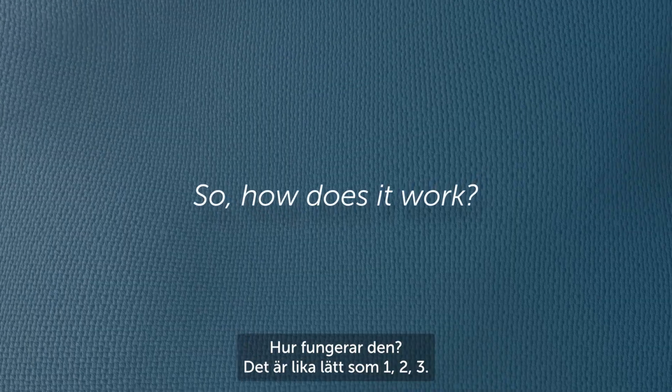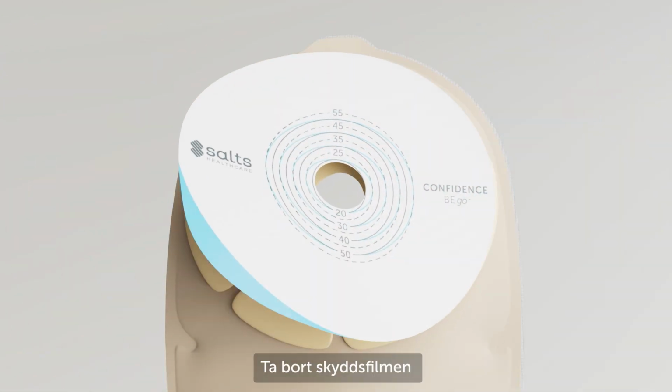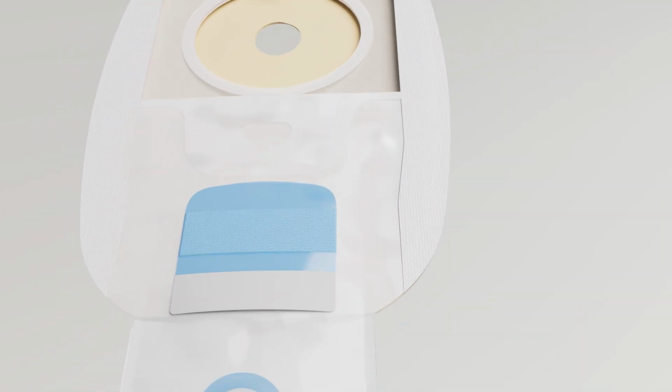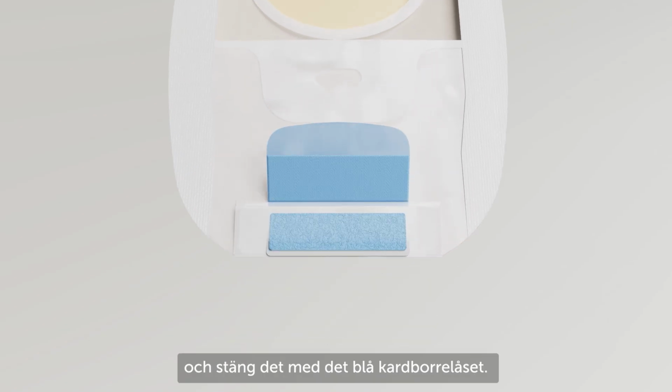It's as easy as 1, 2, 3. Peel off the paper release from the adhesive wafer. Adhere the naked bag securely to your body. Fold the outlet all the way up and secure with the blue hook.